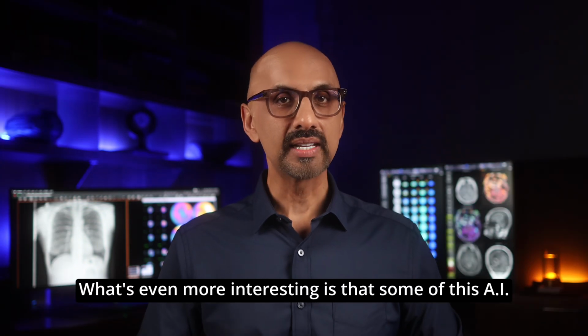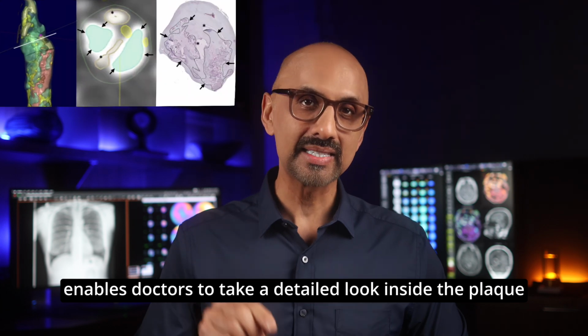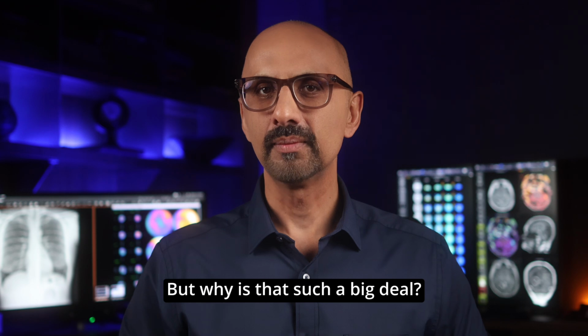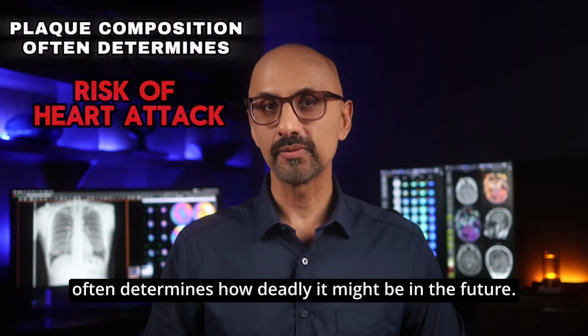But what's even more interesting is that some of this AI-powered software enables doctors to take a detailed look inside the plaque to see what it's made of. But why is that such a big deal? It's because the composition of the plaque often determines how deadly it might be in the future.